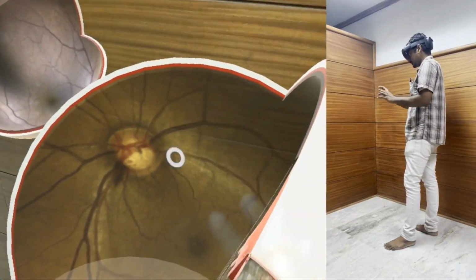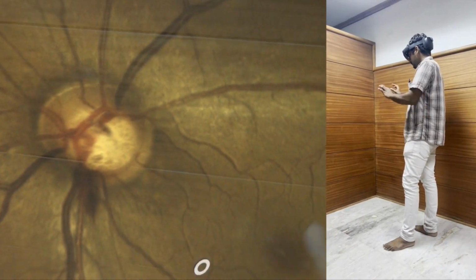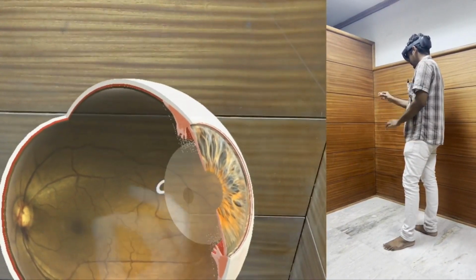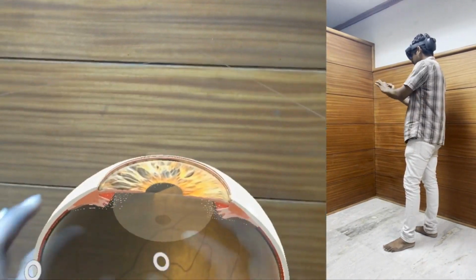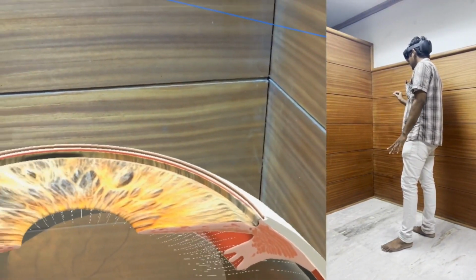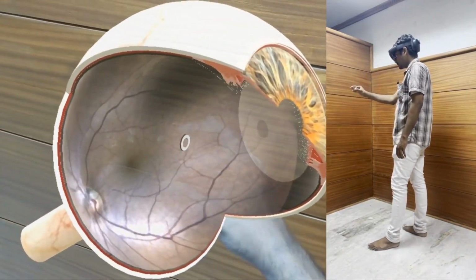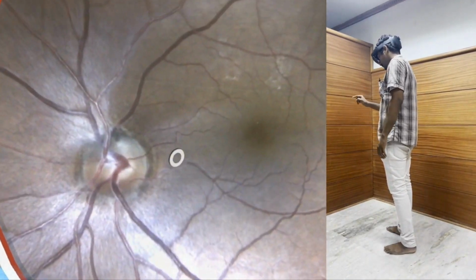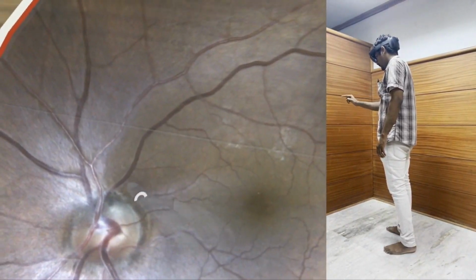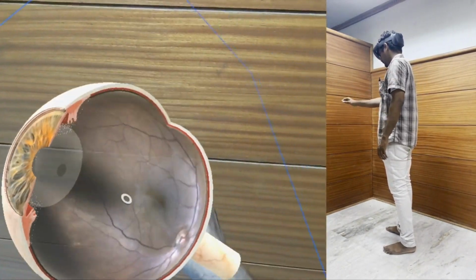In this video, on the right-hand side, you can see the person using the HoloLens, moving his hand in thin air, and the left-hand side part of the video shows what he actually sees through the HoloLens. The eyeball model created by us using a real fundus image with splinter hemorrhage is being demonstrated. The user can rotate and zoom the model accordingly. Similarly, the angle structure can be viewed. Also, there are models showing the RNFL defect.